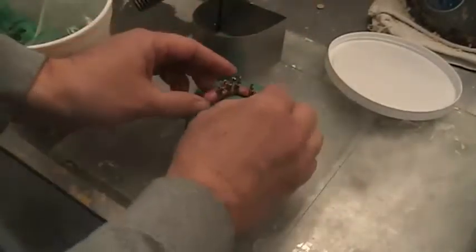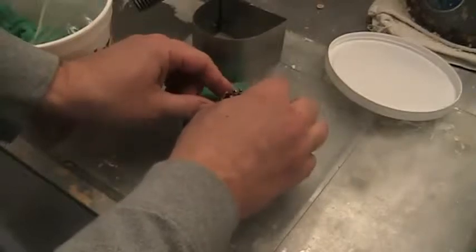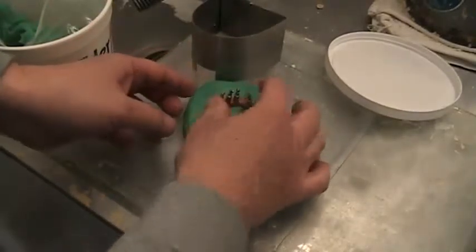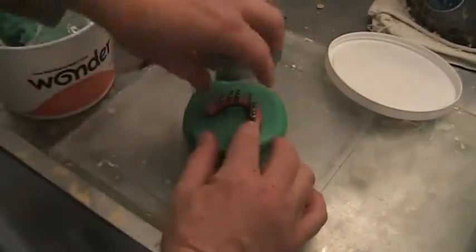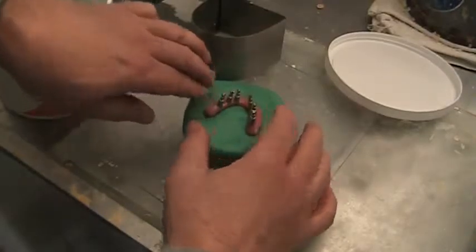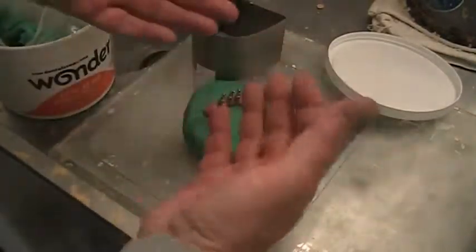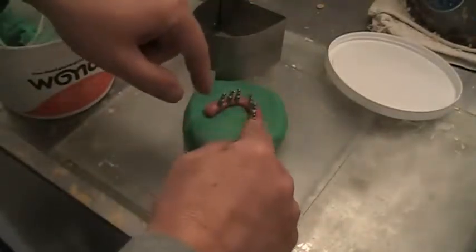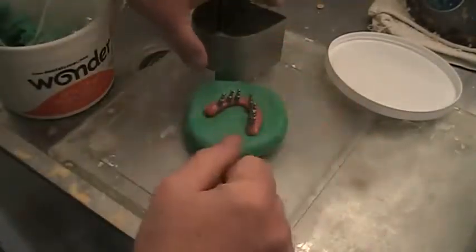And then what I want to do is submerge my bar. Now remember, what we want to do is preserve the tissue bearing side in stone, so that when we go to process, of course, we have that nice leak-free area. There are no seams around the abutments or anything like that. That's one of the reasons I like it.